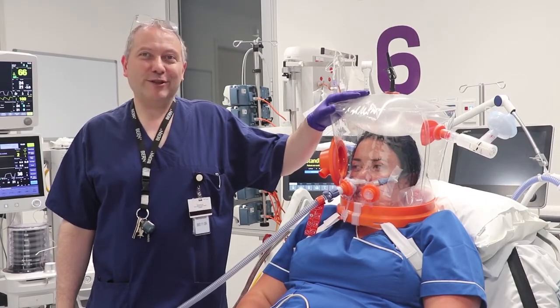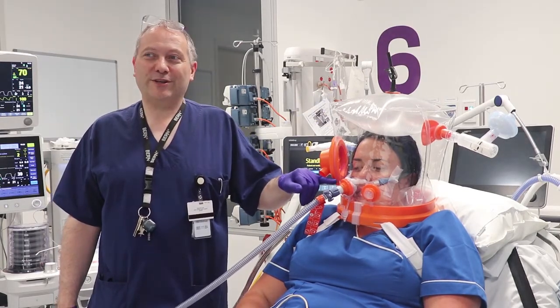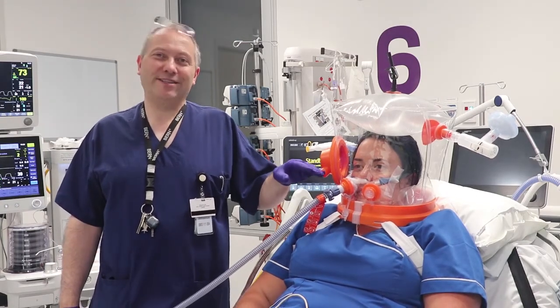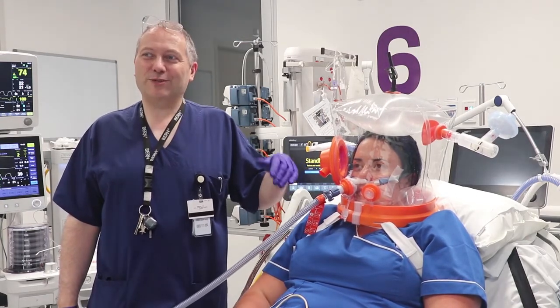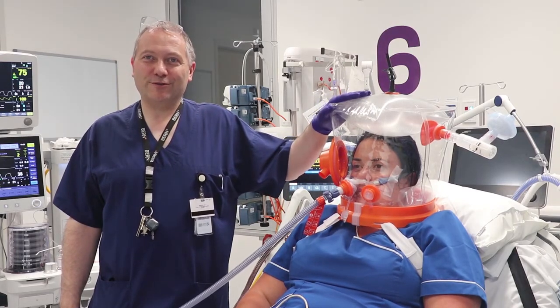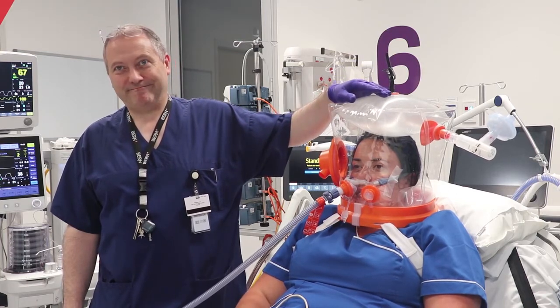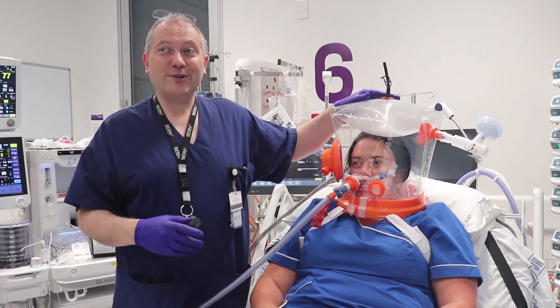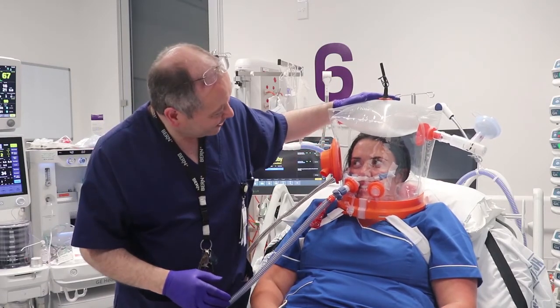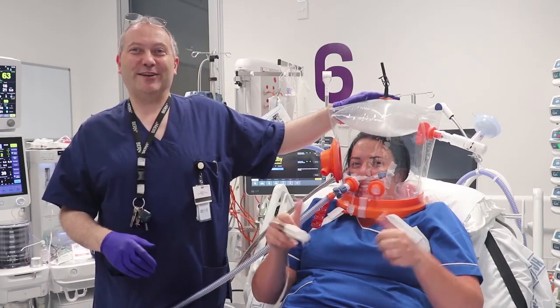Finally, it is important to note that we are delivering high FiO2s to Carla of warm humidified gases — ideal for maintaining ciliary function and expectoration of sputum — whilst using very conservative oxygen flows and delivering effective CPAP. Carla has now been in the helmet for around two hours, and we check in with her on how she is doing.